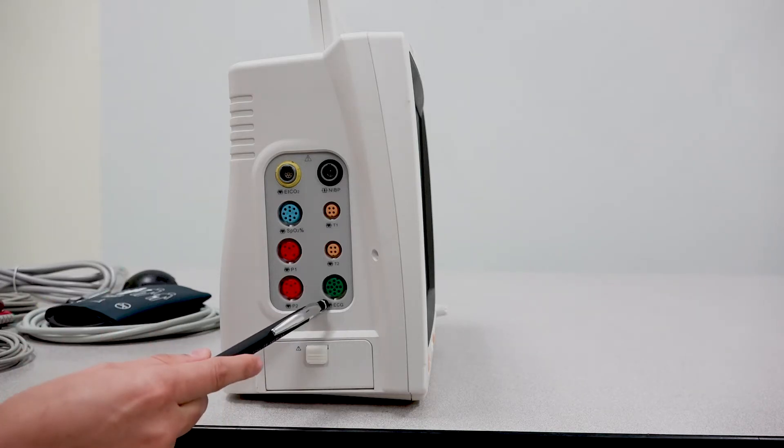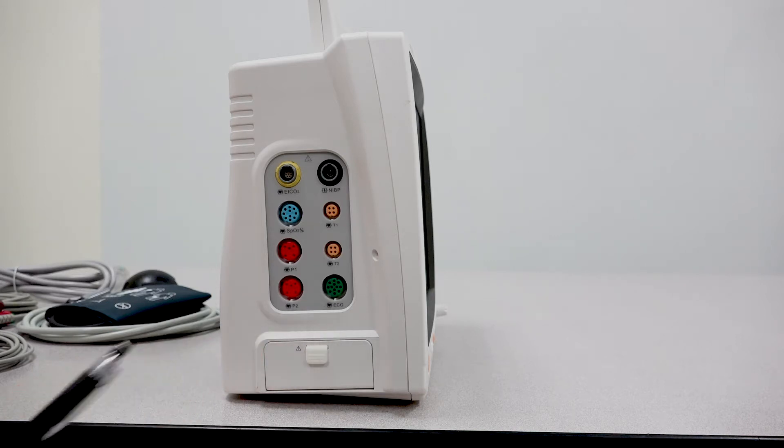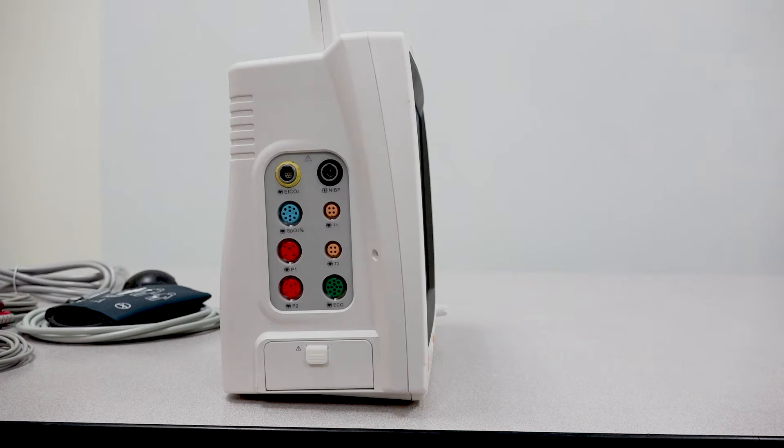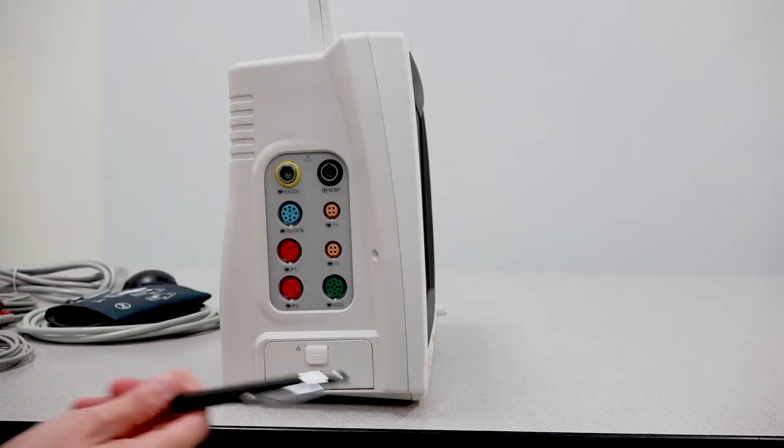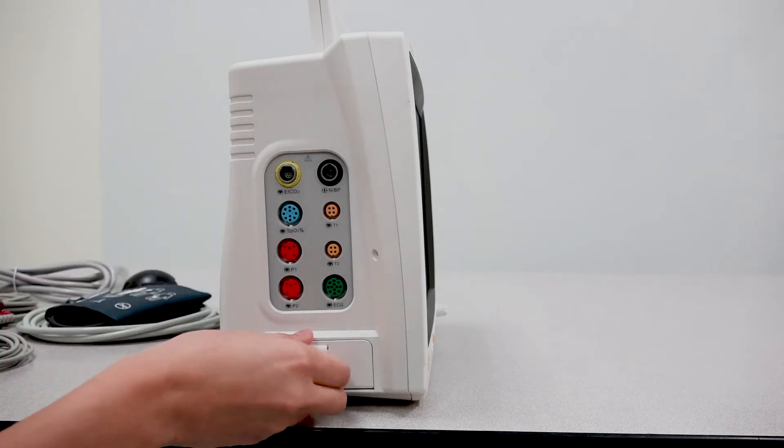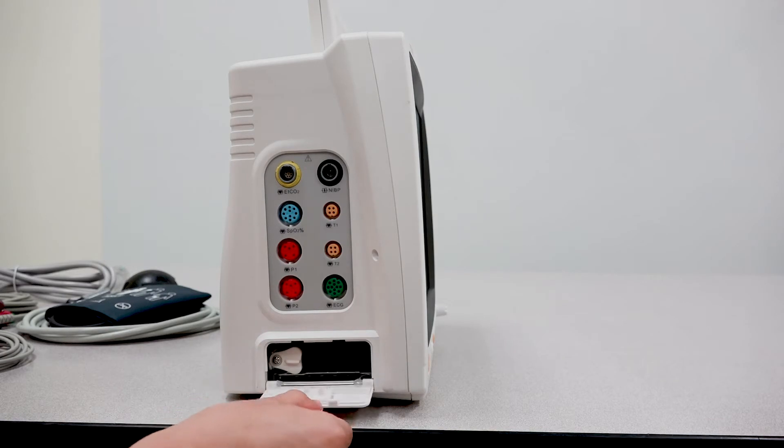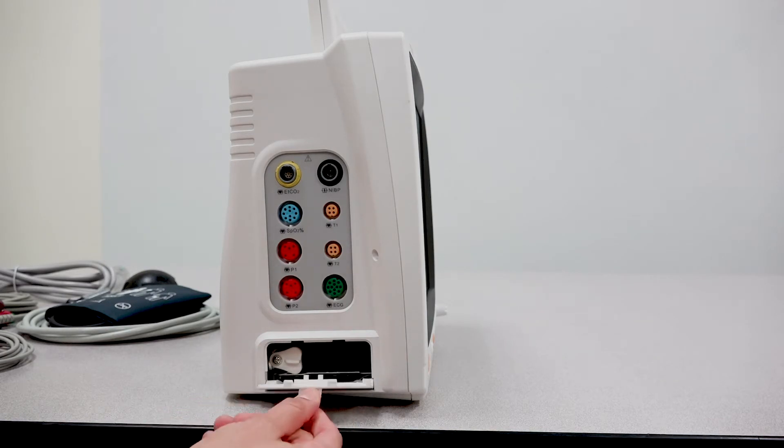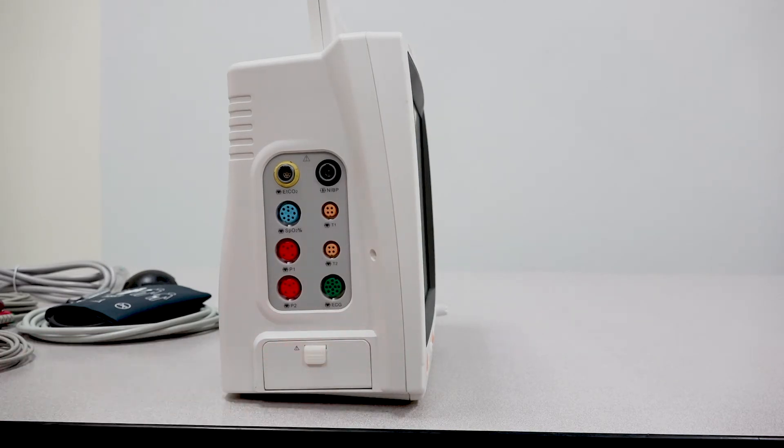For your ECG port, please know that you do have the ability to select a 3-lead or 5-lead patient cable. And underneath the parameters you'll actually find the battery door. If you ever need to replace the battery, this is where you'll be able to find it.